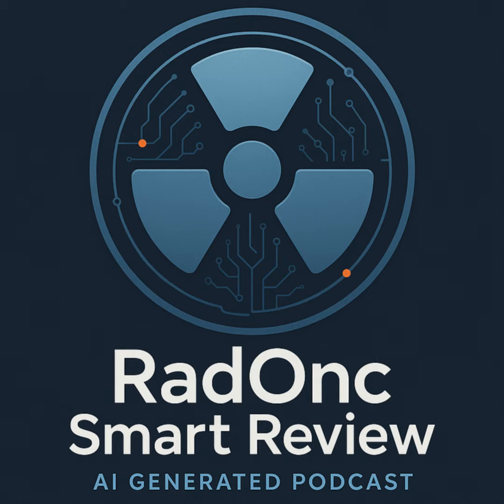So just to wrap things up then, we've covered PET, its physics based on positron annihilation, coincidence detection of those back-to-back 511 keV photons, how SUV gives us a metabolic snapshot, and its huge role in staging and target definition using PET-CT. And then ultrasound based on high-frequency sound waves, piezoelectric transducer sending and receiving, echoes generated by acoustic impedance differences, and that crucial trade-off between frequency, resolution, and penetration.